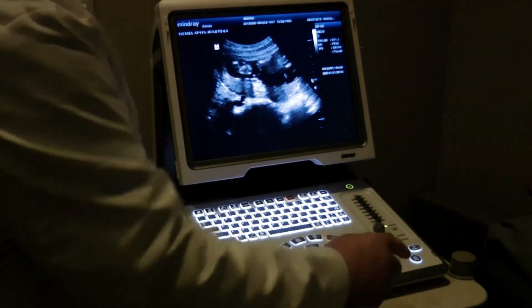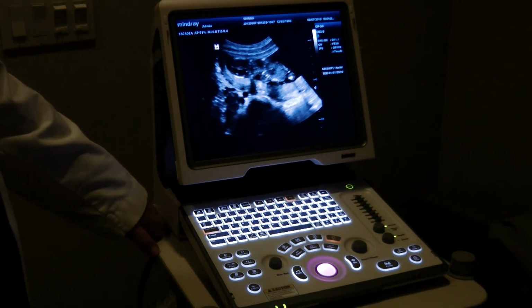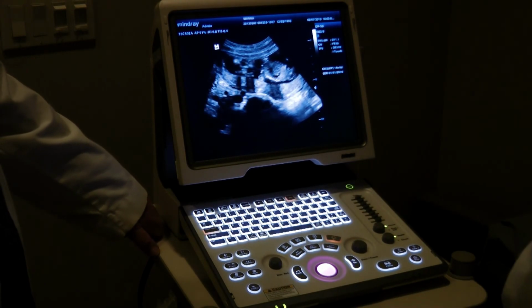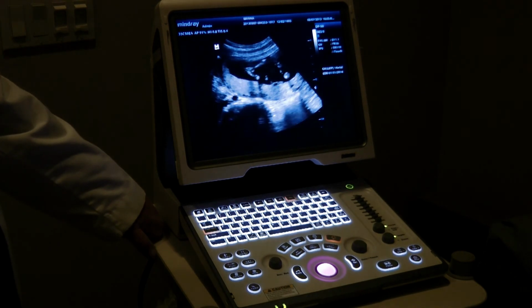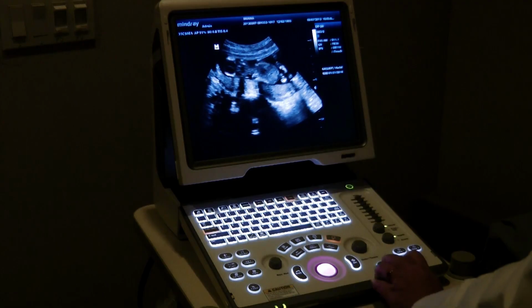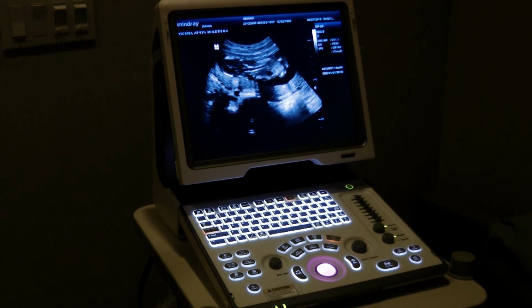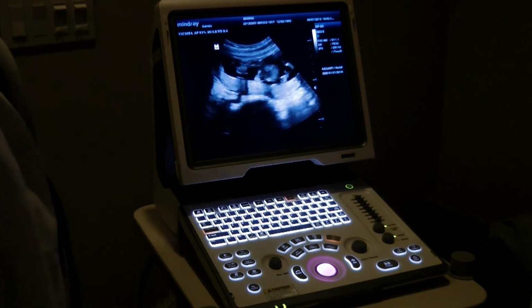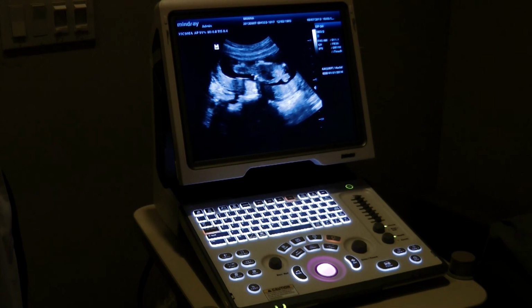And so now you have that on your video. Oh, isn't that great? Oh, here he goes again. He's a moving little person there. I told you guys. I told her. Oh, look at her. I want to capture that one. This baby's awesome. Okay, there you go. Okay, so there we go.